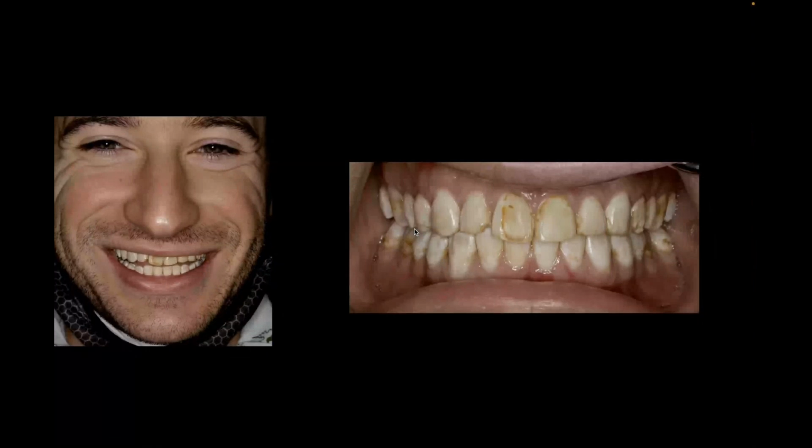So when I work through my cases, I do them the same way all the time. I look at the patient's face, I look at where the incisal edge belongs, and I try to evaluate what we could do to help that patient, not only aesthetically, but functionally. So this case was an interesting case because he was obviously very unhappy with his teeth, and he presented to an office, and the office was kind of ready to put some veneers on it. And when myself and my partner doctor got a look at this, we were like, no, wait a second. There's a lot of little issues here that we're going to need to work through. So this actually wound up being an orthodontic case that we moved the teeth around.